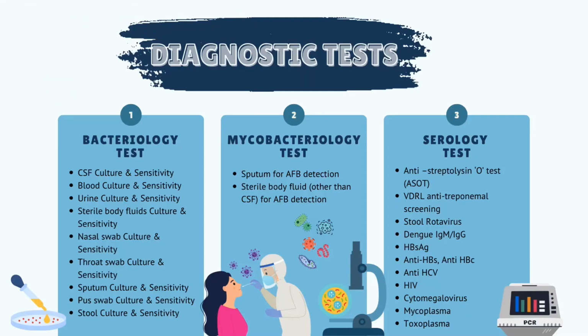These are several diagnostic tests that are available in the microbiology lab. As you can see, the bacteriology tests, most of which involve culture, and the samples required are CSF, blood, urine, sterile body fluids, nasal swab, throat swab, sputum, pus, stool, and there's a lot more like vaginal swab, ear swab, eye swab, and so on.